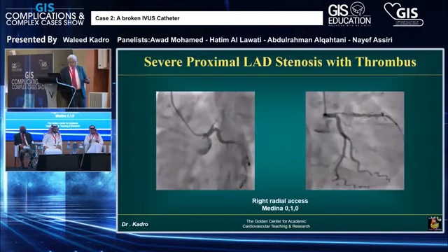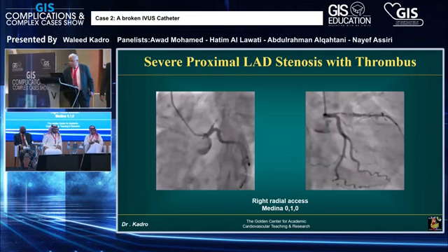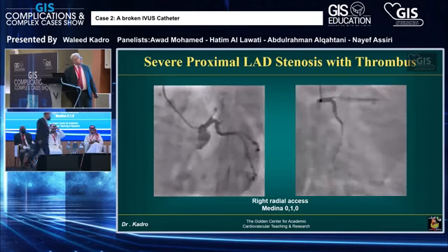So this is a fixed picture. Is there any laser pointer? Anyway.